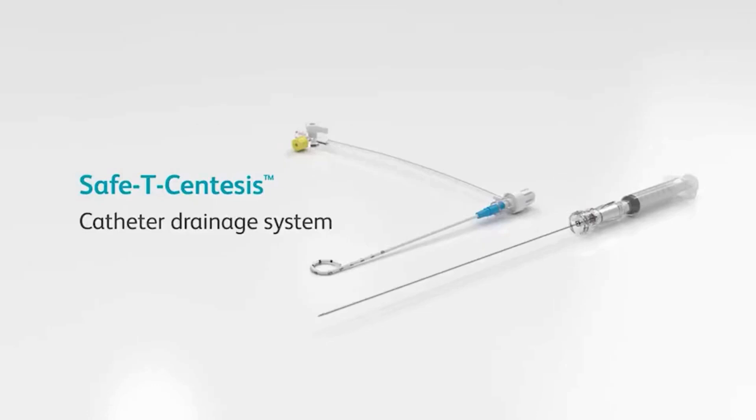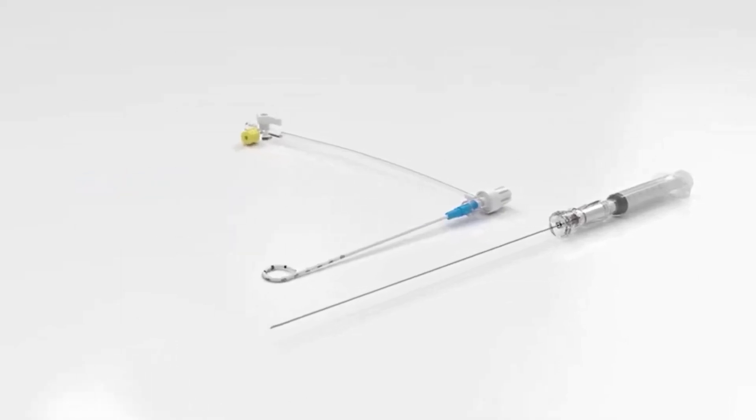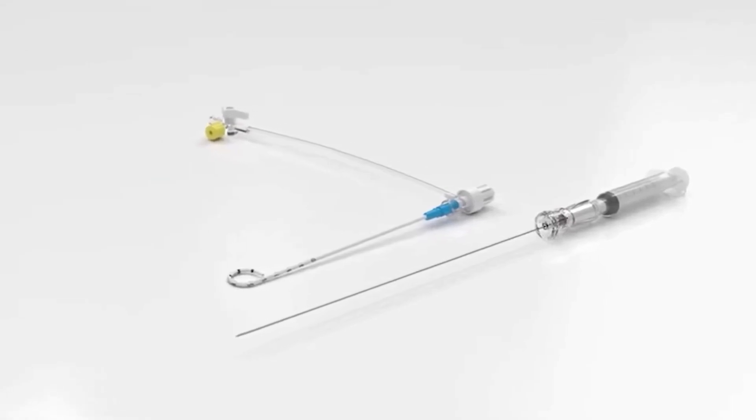The Safety Centesis Catheter Drainage System is designed to help reduce the risks associated with percutaneous needle placement, while also helping to enhance patient comfort during thoracentesis and paracentesis procedures.